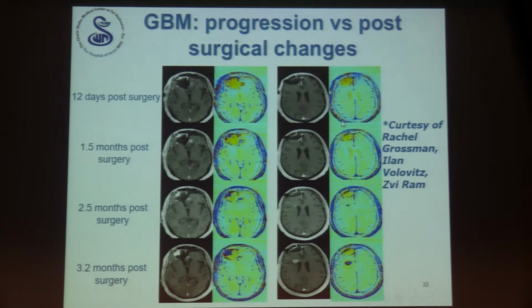This is another patient on the same study. And here, on the other hand, we didn't see anything suspicious in this part that crossed the midline. It did become blue after some time, and then it disappeared again. So I'm not sure, but this part of residual tumor in the surgery site, this one did grow with time. So it's really hard to say.